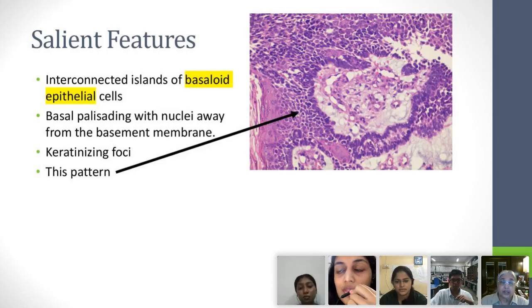Now you see the stellate reticulum, which maybe you didn't even recognize. There are these interconnected cells, which look almost as if it's a jigsaw puzzle that has been shaken loose. So that's the stellate reticulum that is being seen in these cells.